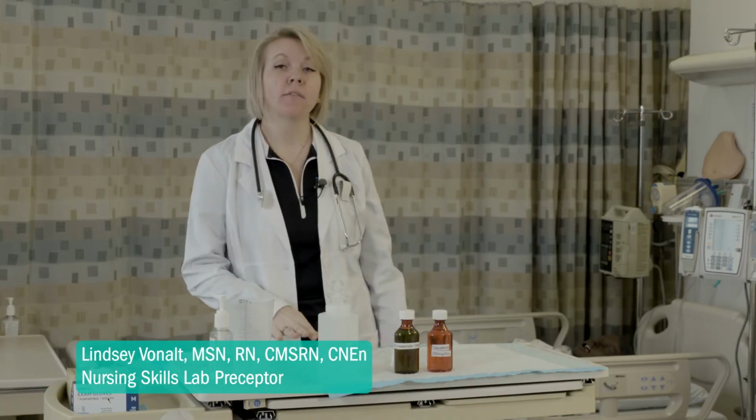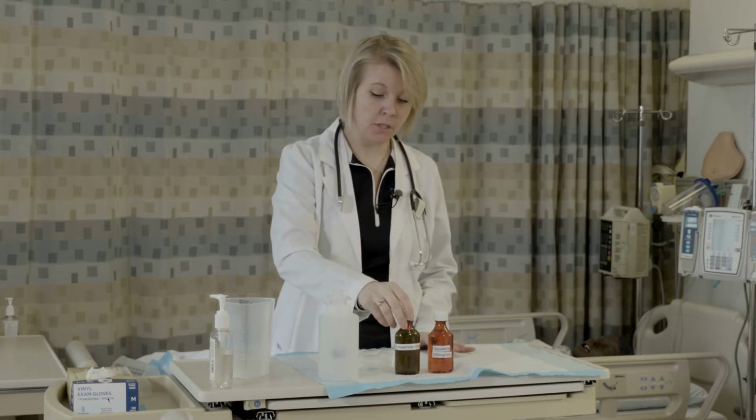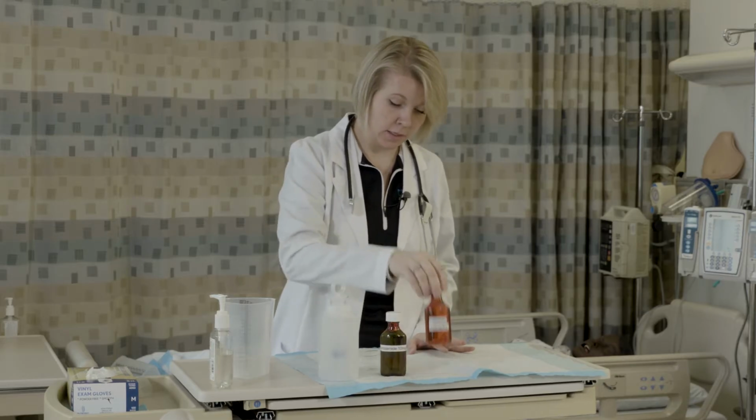So right now, we're going to give our patient medications through our NG tube. The first thing, just like always, we're going to start by checking the patient's orders from the physician. So it looks like our patient has ordered Lasix as well as Depakote. So we have those two medications.